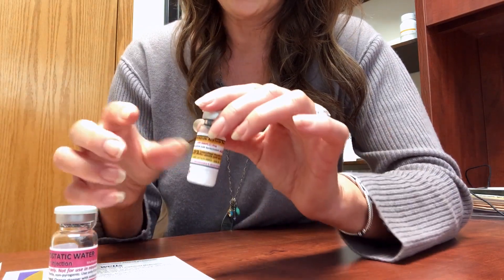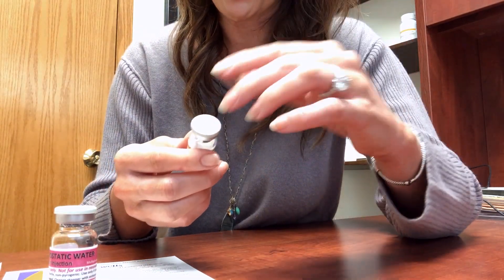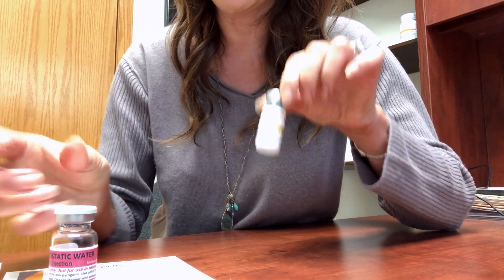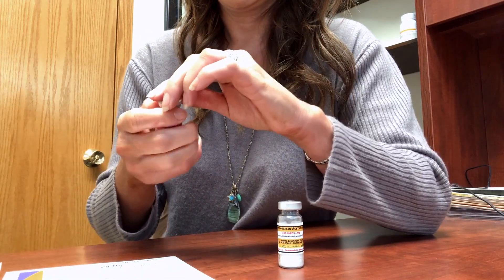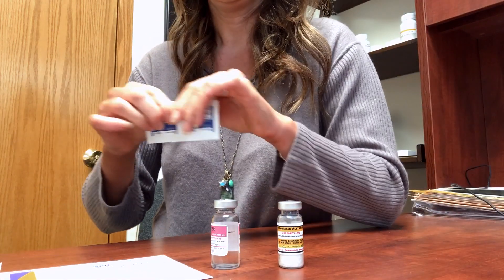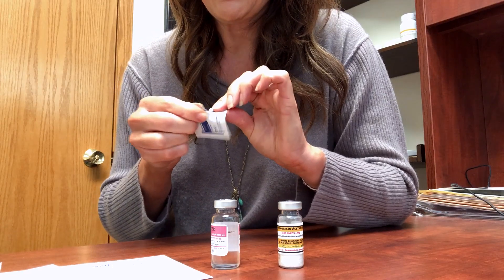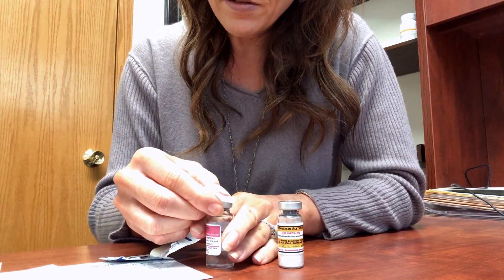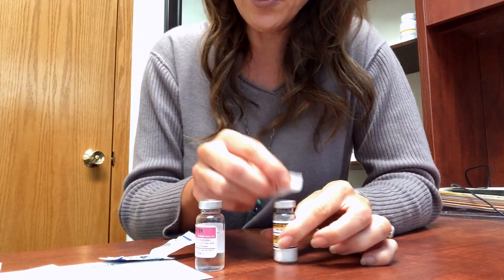After you've washed your hands really well with soap and water, go ahead and just pop off the tops. Then you want to take an alcohol wipe and clean off the top of each of them.